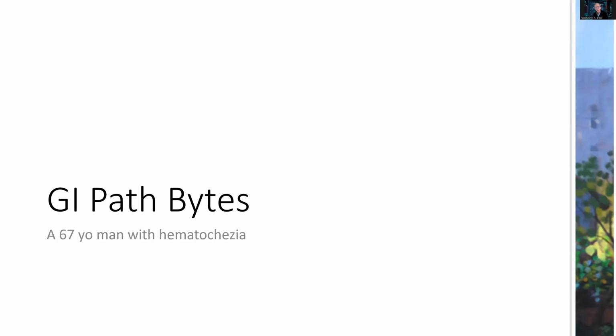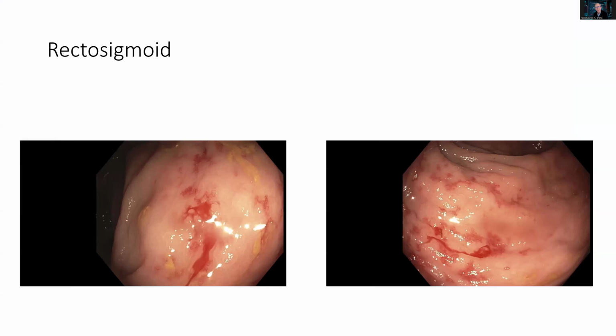It's evident pretty quickly to the endoscopist what is going on as he, shortly after entering the bowel, discovers a mucosal appearance that looks like this in the rectosigmoid. And as you can see, here we have the normal mucosa, nice reflectance here, and areas of an abnormal vascular blush here in a somewhat irregular and branching pattern in a couple of different areas.